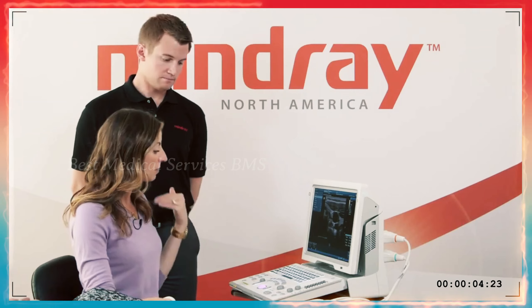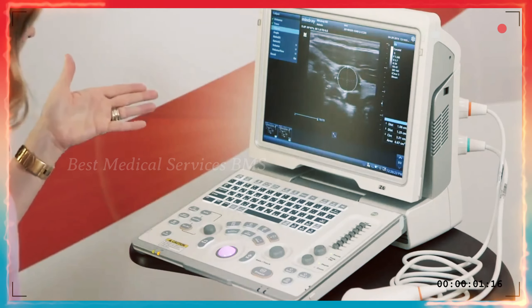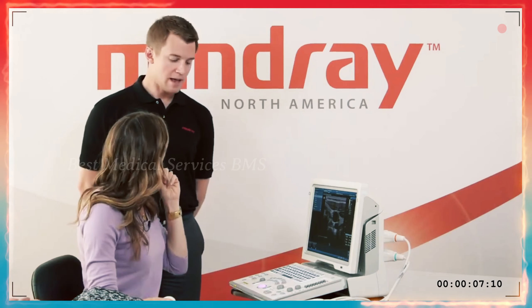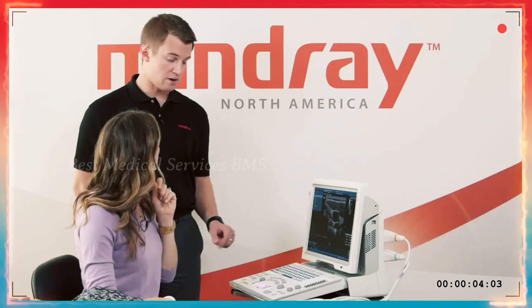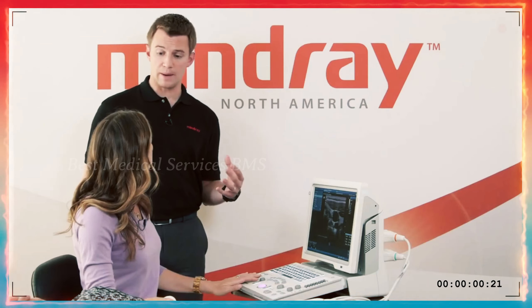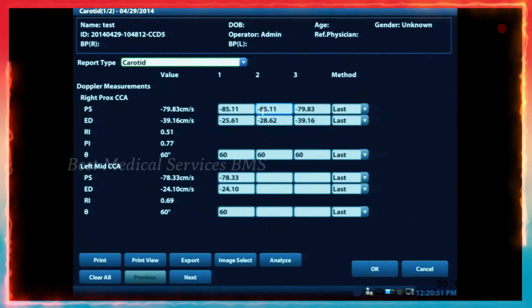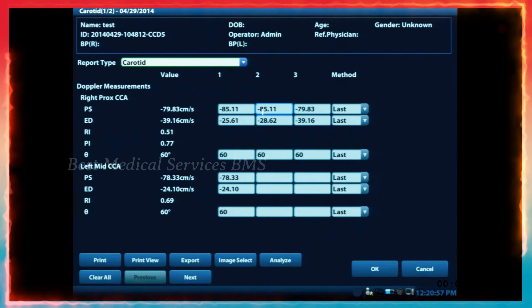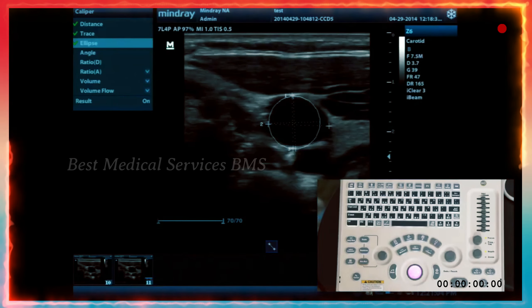If you don't like a measurement — say you put something in the calc package and want to delete it — the system saves up to three measurements per segment. If you hit report, it'll pull up all the calcs you've done in your calc package, whether OB, abdomen, or vascular. From there, you can click on measurements and delete them using the backspace button. So if you've taken three on each segment and don't want to keep the last one, you can go in there and delete it.